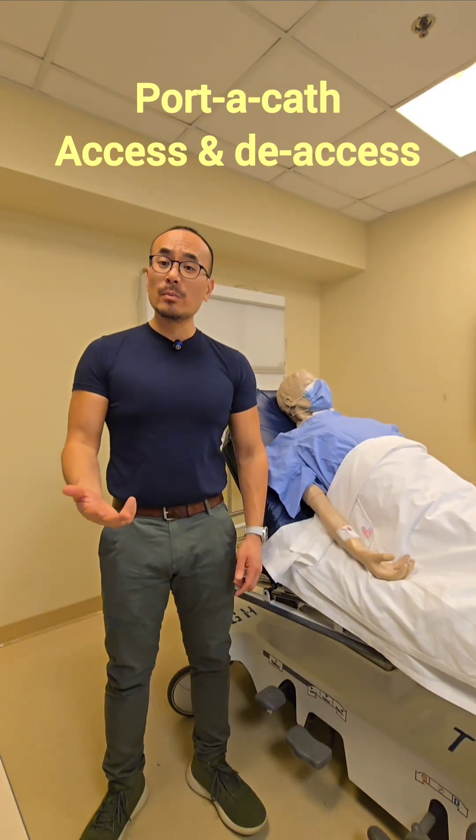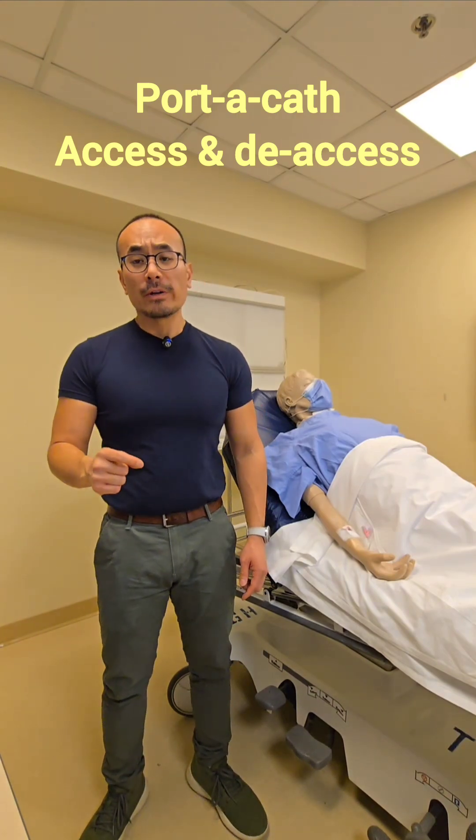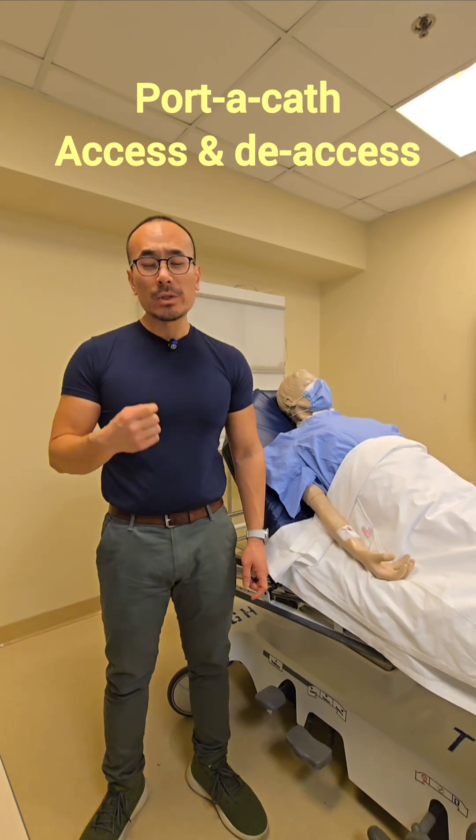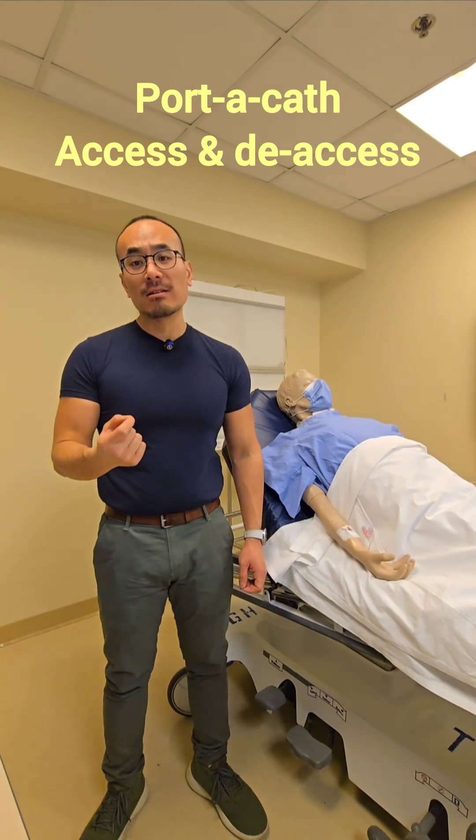Hello everybody, this is Carlos and welcome to another video. In today's video we're going to learn how to access and de-access a portacath, which is an implanted central vascular device.